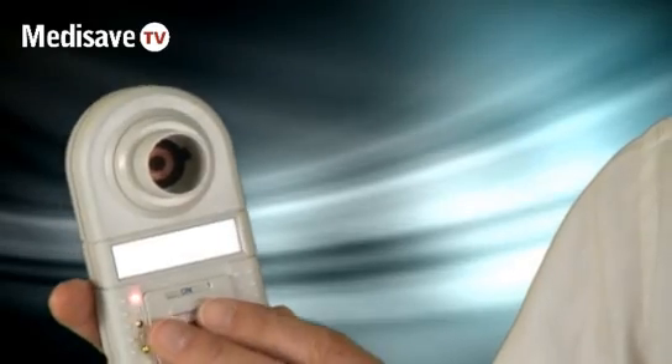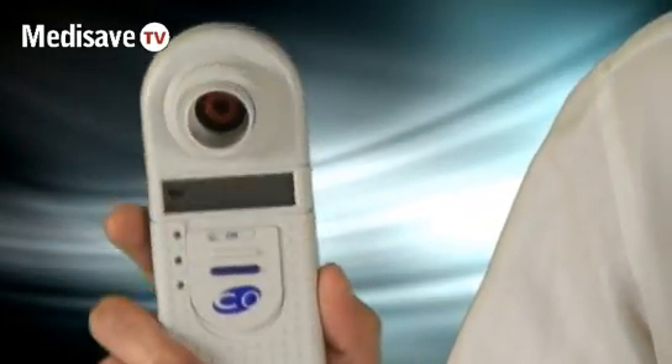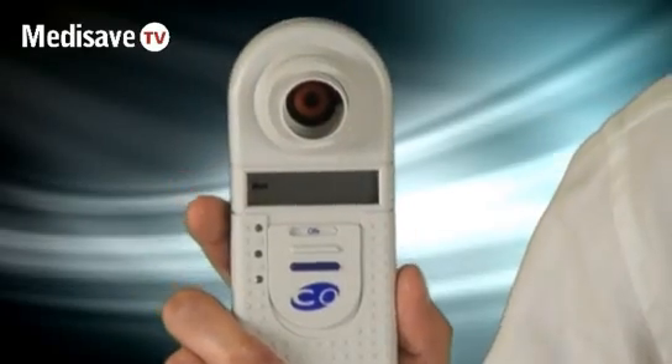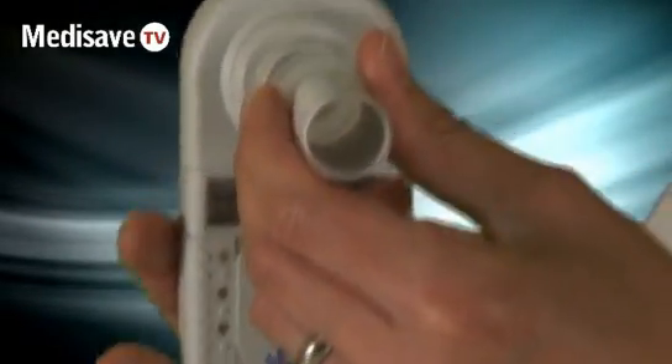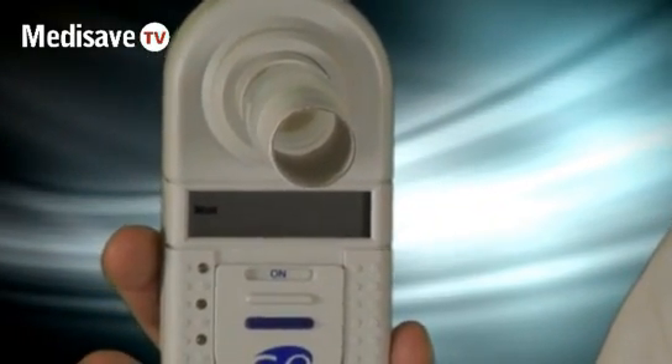You simply switch it on and the device will say 'wait', asking the patient to take a deep breath, inhale, and hold their breath until they're ready to blow out. The machine will tell you — if we just pop the mouthpiece in, I'll just wait. It's normally about 10 seconds that this device will wait for.